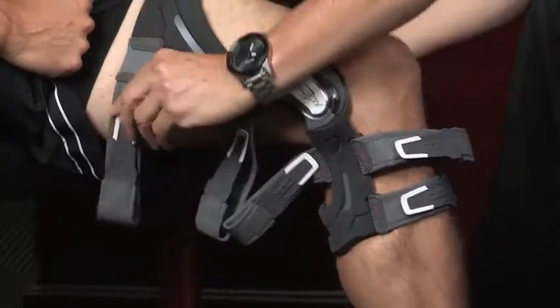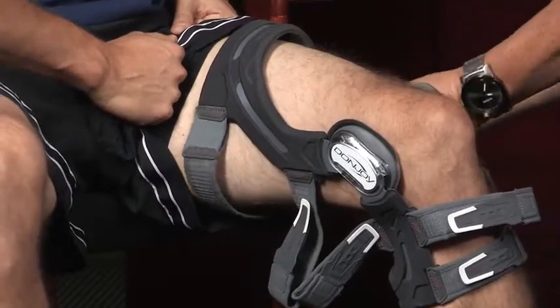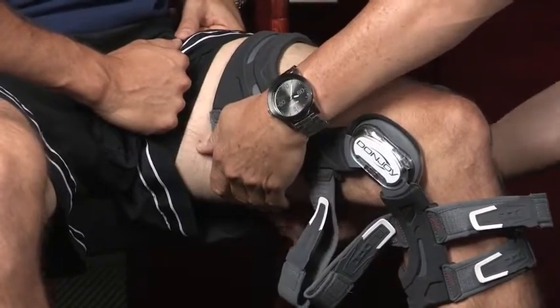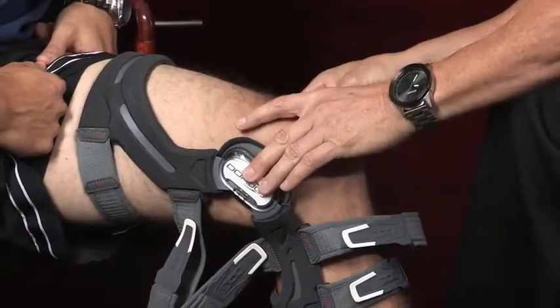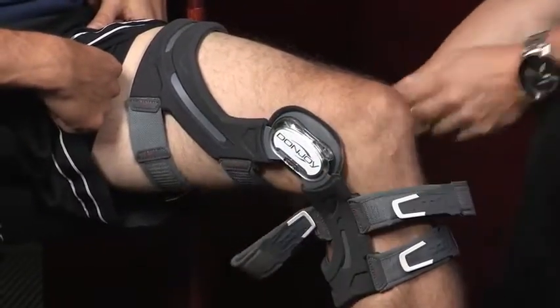Number two is your posterior thigh strap here, and it also has a number on it as well. Pull it through the ring, you cinch it up — comfortable, but you don't have to over-tighten it at the beginning. The number three strap — and you can see the hinges here are a little bit posterior, and that's fine — is just right below the number two strap.